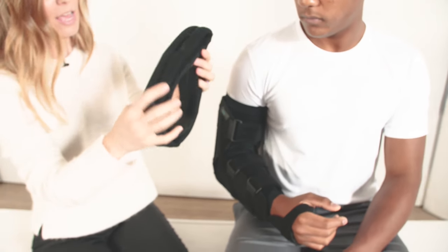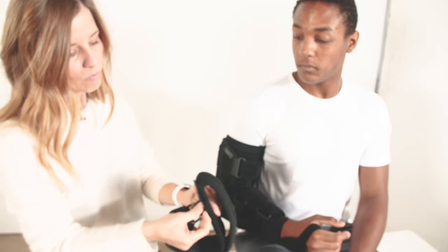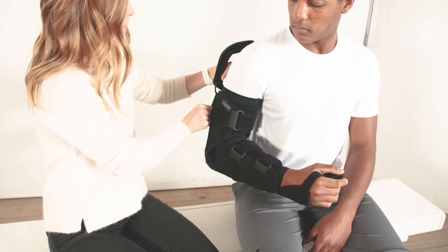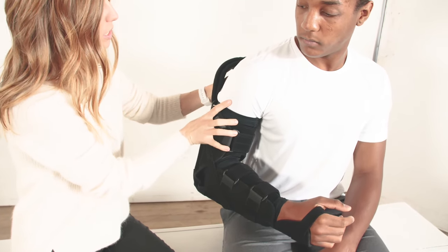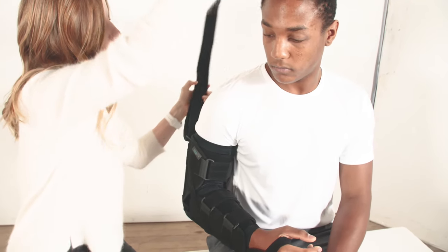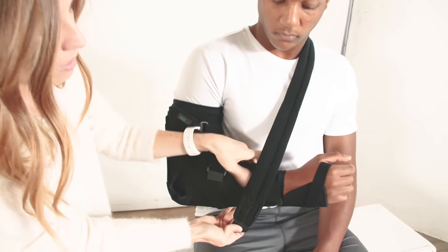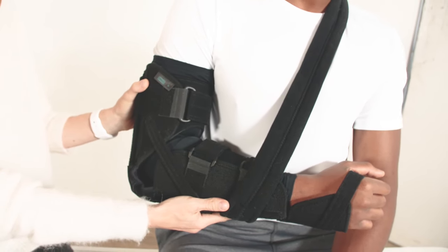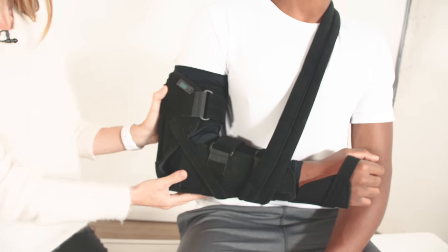Lastly, if needed, I have the sling strap. I'll take the o-ring and place it on the back of the brace right where it was when you took it out of the package. Like any other sling I'm going to go around his shoulder and neck underneath, and this will just adhere to wherever is comfortable and needed to give him the support of a sling when needed.